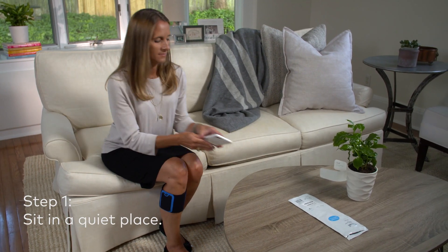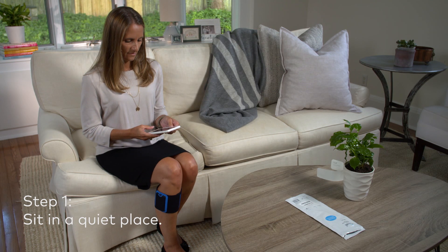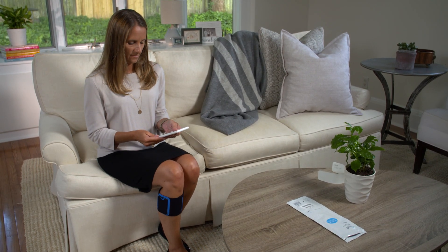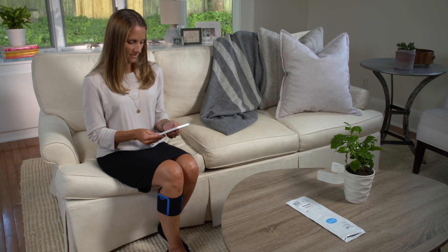Sit in a quiet place where you can focus. Calibration is going to personalize the stimulation level for you. As a result, you will run through a series of sensation assessments, where you will indicate within the app when you feel a tingling sensation where the electrode is contacting your skin.